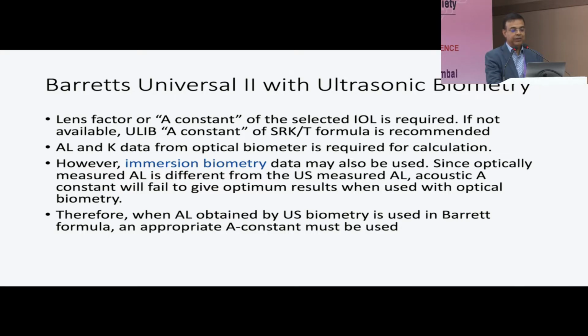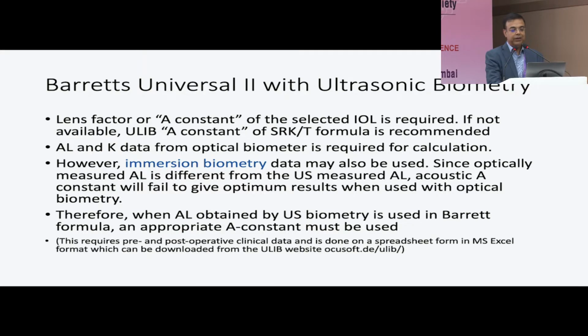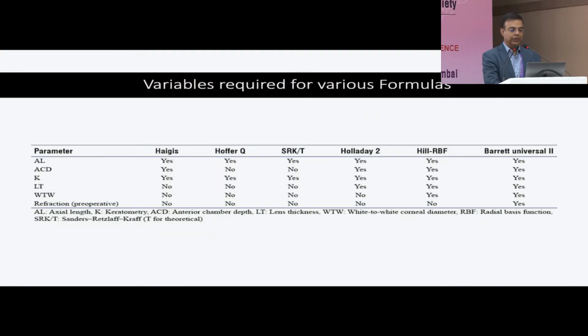And then, of course, it's very important to compare this data with the fellow eye. I always like to compare my manual measurements for the fellow eye. If you have discrepancy between the two eyes, you can immediately be alerted, and you can go back and look at it again, especially with posterior staphylomas and all, where you might go wrong with these eyes.